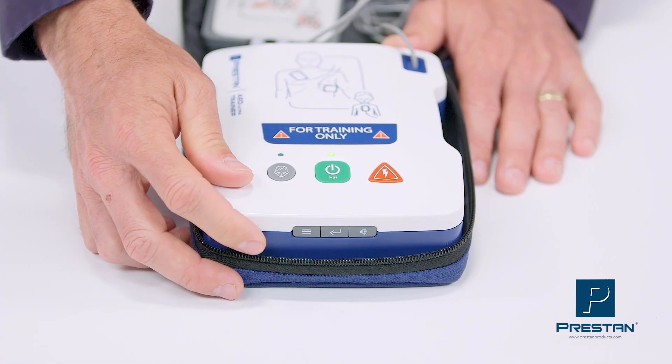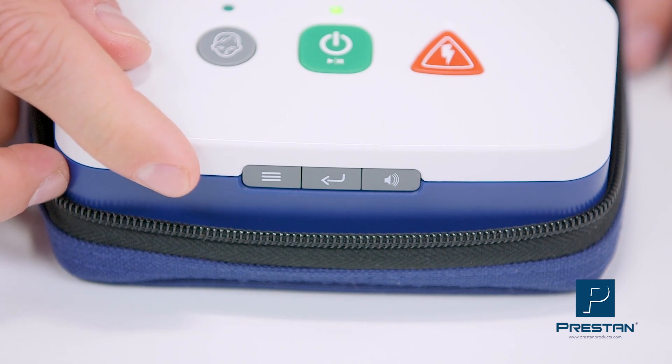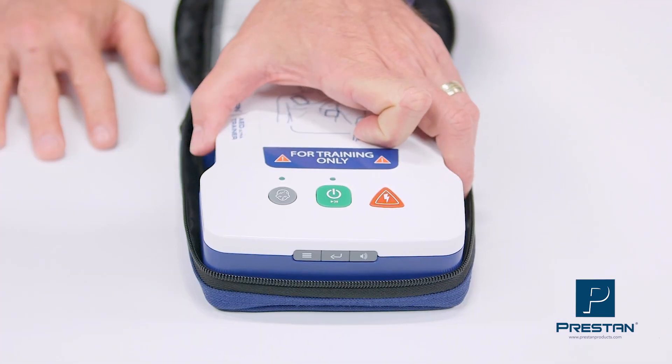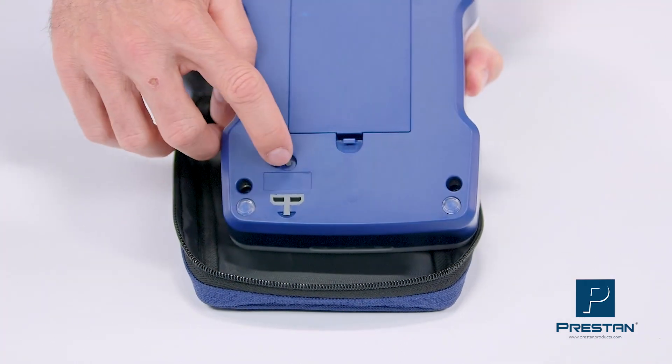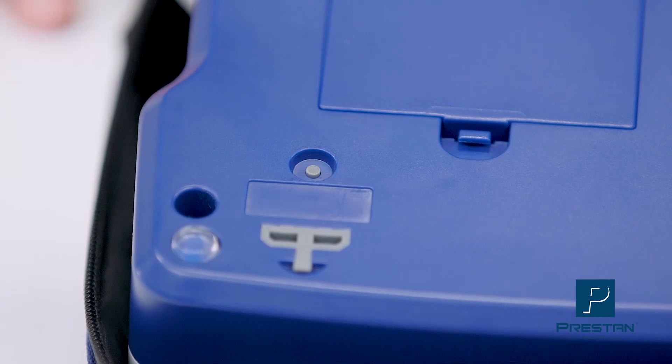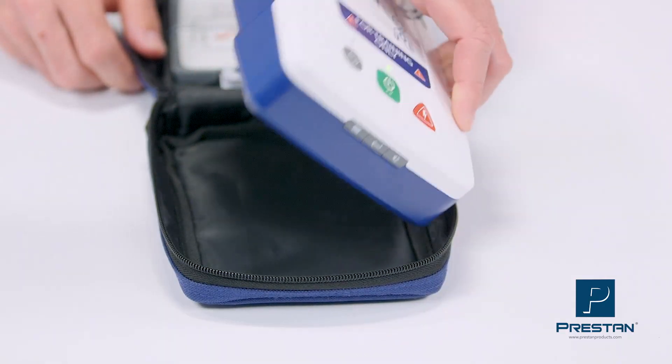Options include ventilations on or off, CPR metronome on or off, the ability to easily switch languages — including Spanish and English — and update software when the guidelines change.